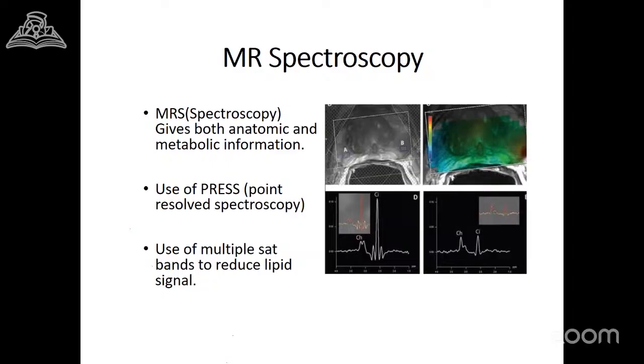Multiple saturation bands are also applied to reduce the unwanted signal from fat, improving the quality and accuracy of the metabolic information obtained in the curve.